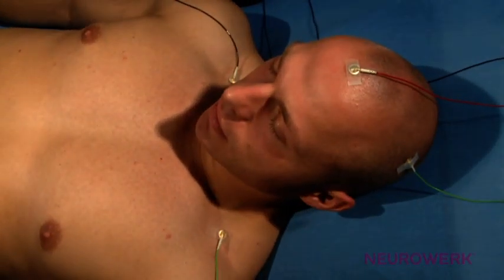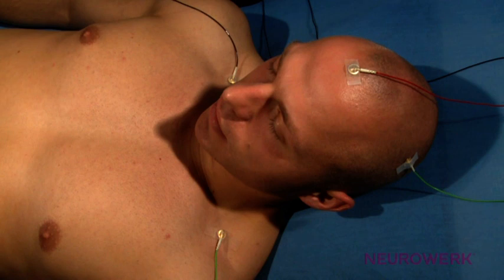The SSEP examinations should always be performed with the patient lying down in order that muscular relaxation can be achieved. Through the patient closing his eyes and slightly opening his mouth, there will also be a reduction of muscle artifacts.